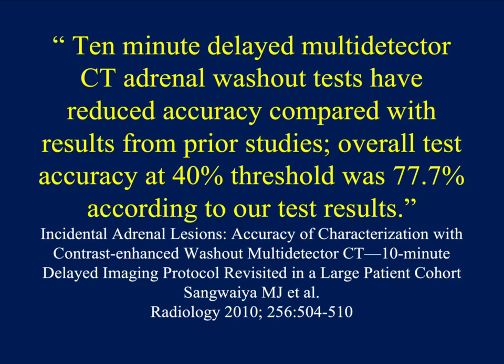Now, we mentioned that when we do delayed scans, typically when we look at an adrenal workup, you do a non-contrast, you inject 100 cc's of contrast, you scan at 1 minute, which is basically venous phase, and then you come back at 15 minutes. Now, 15 minutes is a long wait. People have tried doing a 10-minute wait, but you can see test accuracy was much lower. So, yes, sometimes things can wash out at 10 minutes. Most of the time, it's going to take you 15 minutes, so just get over it.